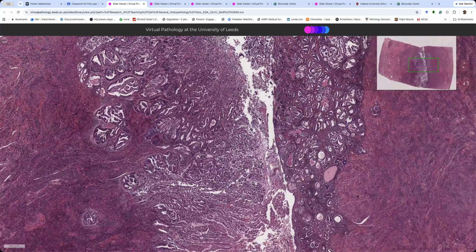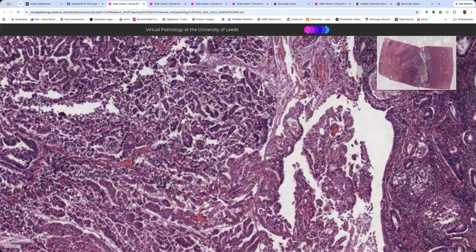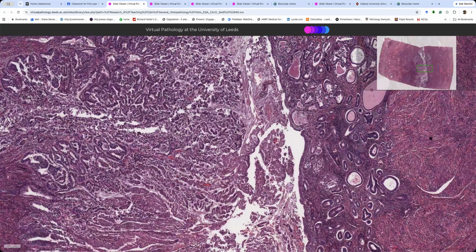But what we're thinking about is this. All right. This is autolysis, or as I like to call it, porridge. Oh, man, I hate autolysis. The registrars here spend time opening uteruses so that we don't get as much autolysis in the uteruses.